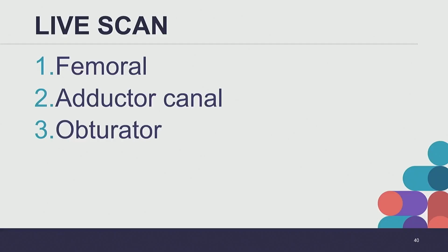So we're going to go ahead. We scanned the femoral already, so we're going to go down and scan the adductor canal and then the obturator as well. And spit out any questions as we're getting set up if you all have any.